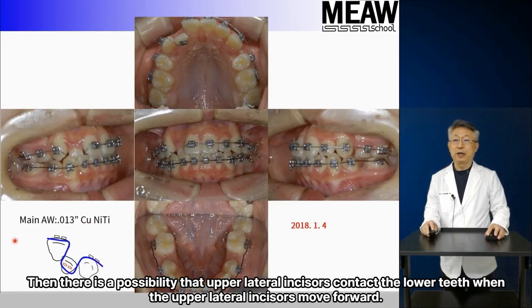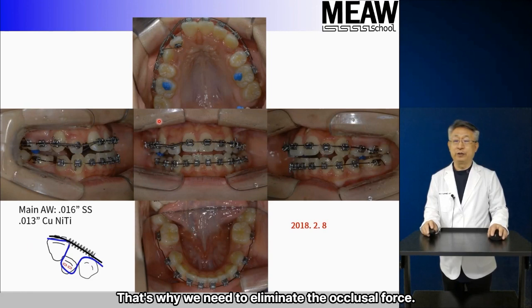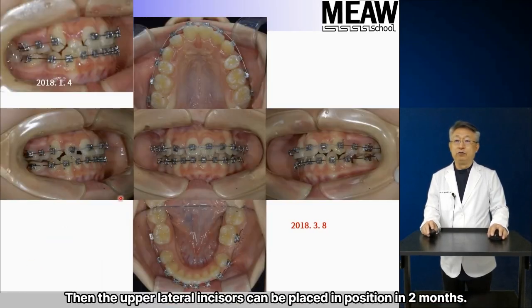Then there is a possibility that the upper lateral incisors contact the lower teeth when they move forward. That's why we need to eliminate the occlusal force. The blue resin is put on the upper first molar, and the upper lateral incisors are moved labially to eliminate the occlusal force. Then the upper lateral incisors can be placed in position in 2 months.